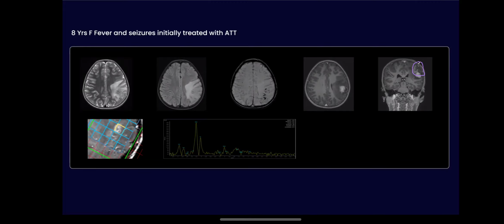Like in this case, you're able to see exactly how the lesion courses, from the periphery to the center. The other thing is on follow-up imaging, you do see some areas of the brain that were previously uninvolved are now involved, which essentially means that it is, of course, disease progression and the fact that the parasite could have migrated. So these are your telltales in terms of how you could predict that it could be a parasitic infection and not your run-of-the-mill tuberculosis.